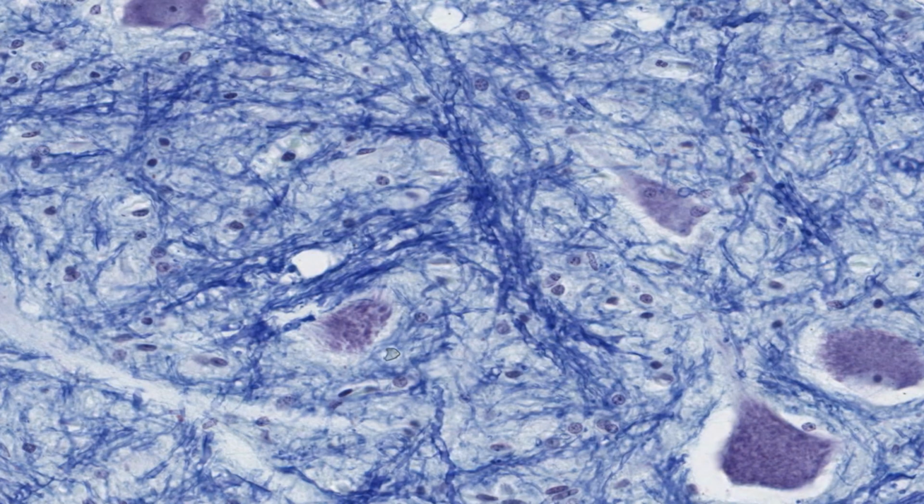These smaller, denser, conspicuously round nuclei, which look like lymphocyte nuclei, are oligodendrocytes. Oligodendrocytes form the myelin in the central nervous system. In addition, a small number of dense, elongated nuclei belong to microglia. But remember, some flattened cells will be endothelial cells of the numerous capillaries, which cannot be seen here as they've mostly collapsed during tissue collection and processing.